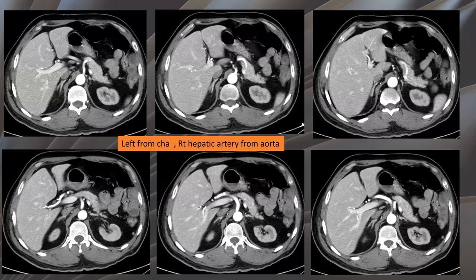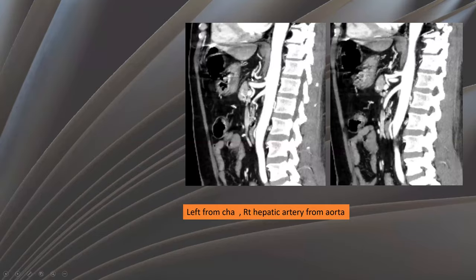Here, the left hepatic artery arises from the common hepatic artery, and the right hepatic artery arises directly from the aorta, as seen here in the axial and sagittal reconstructed images.